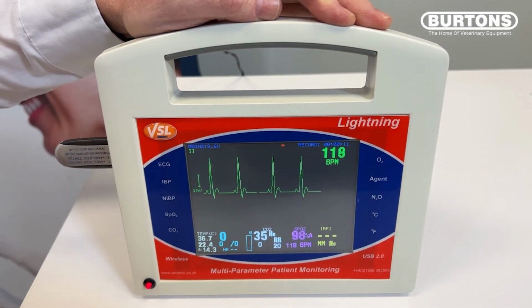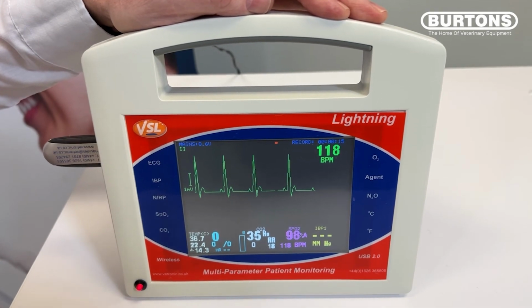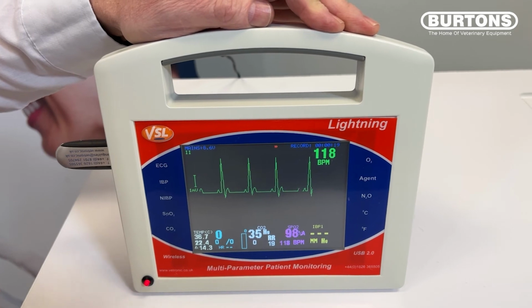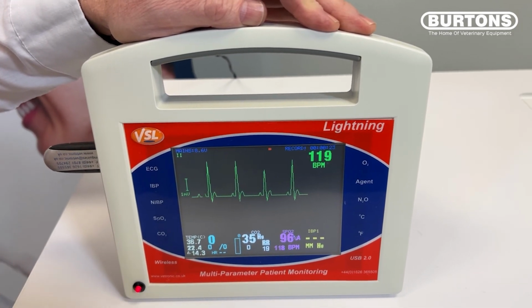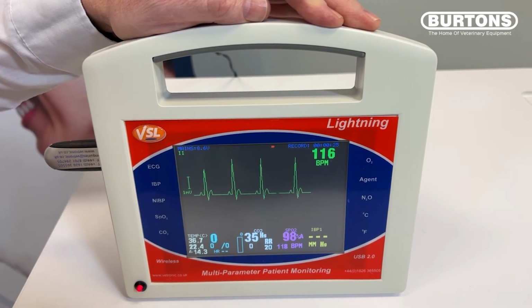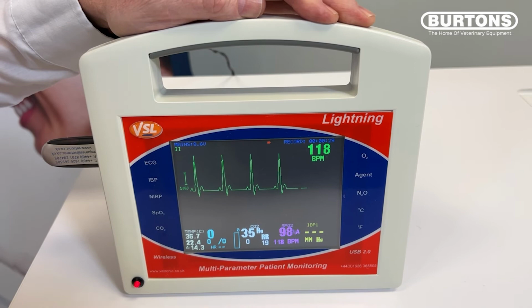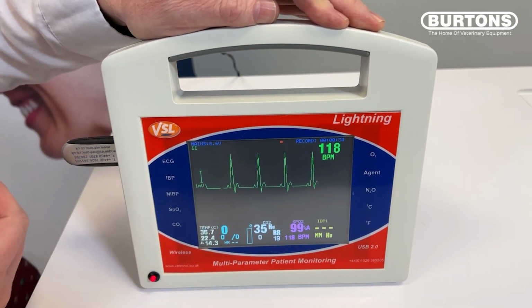So we can make a very short recording. We could maybe do 20, 30 seconds for a dog, or maybe a minute or two for a clinical case. But by the same token, we could put this on the animal, say a collapsed boxer, in a kennel overnight, and do an 8 or 12 hour recording, and then come back in the morning, take the recording and review it for analysis to see if there's any anomalies occurring overnight.